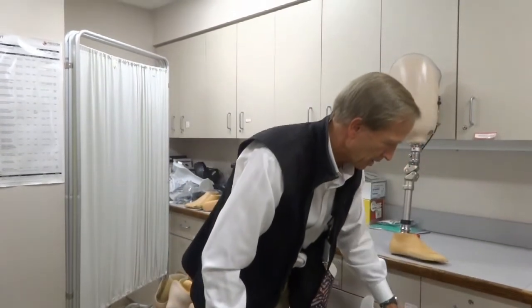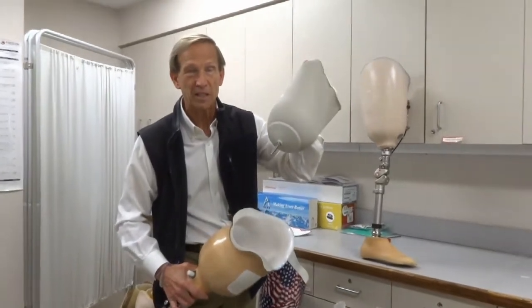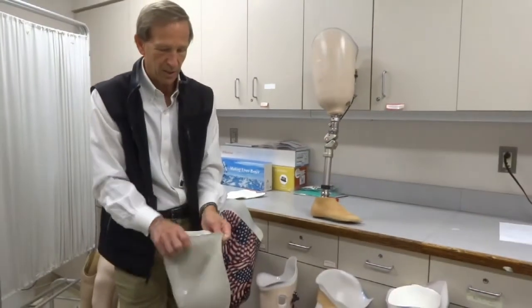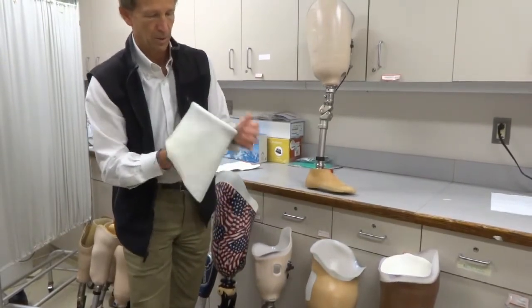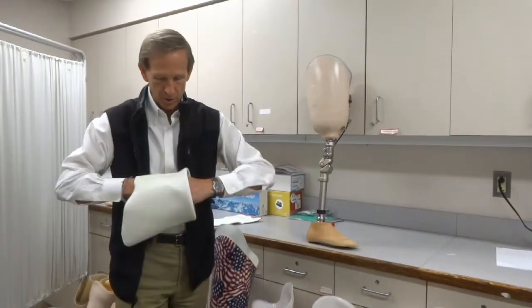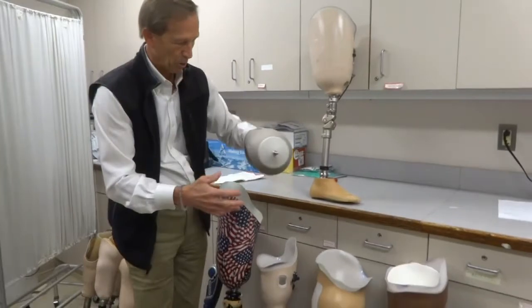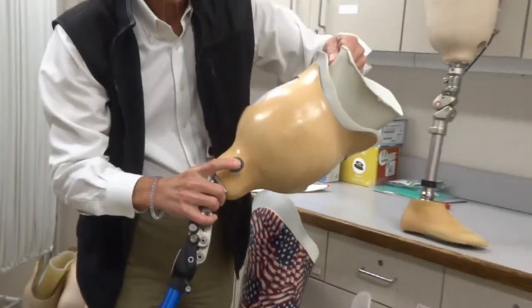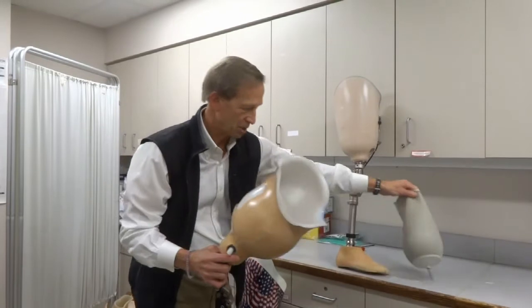Another way of locking you in place is called a gel liner with a pin suspension. We have a gel liner with a metal pin attached at the bottom, and that pin locks into a hole in the bottom of the socket. The patient puts on the gel liner the same way — turn it inside out, invert it, making sure the gel is directly against the skin with no air bubbles, then it rolls on. When the patient steps into the socket, it locks in place and won't pull out until you push the button, which releases it. In this case, the gel liner is both the soft interface and the suspension mechanism.